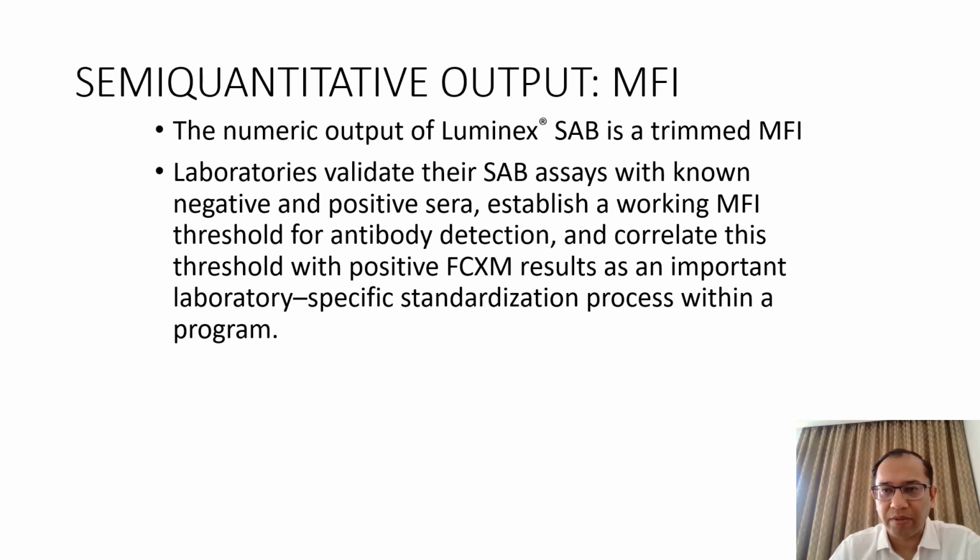The numeric output of Luminex SAB is trimmed MFI. So the lab actually validates it with the other labs and also with the tests that they are employing, like a sensitive technique such as a flow crossmatch. So you have your own MFI cutoff level. Some may keep a liberal cutoff, others may be more conservative in the MFI output.